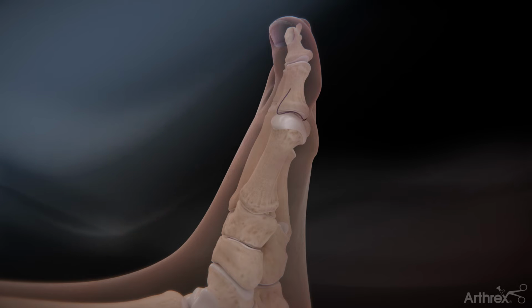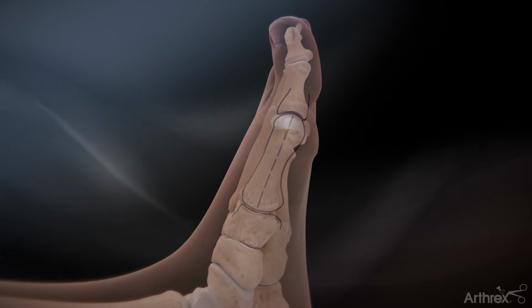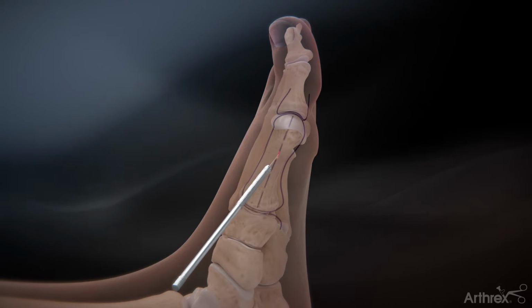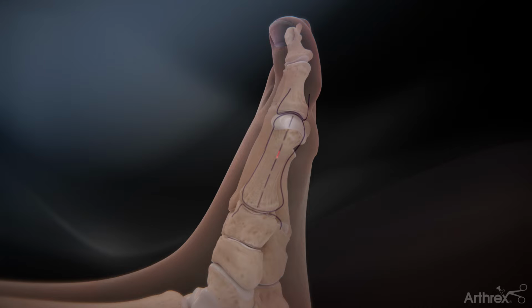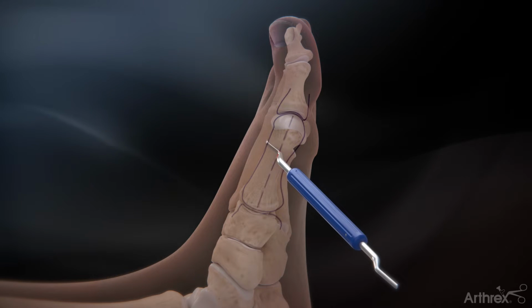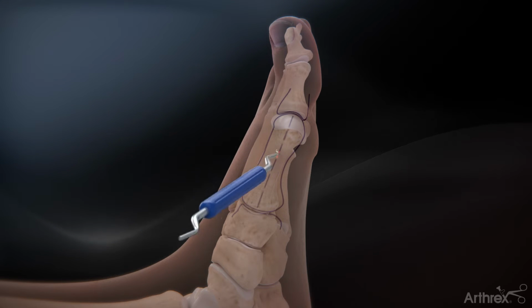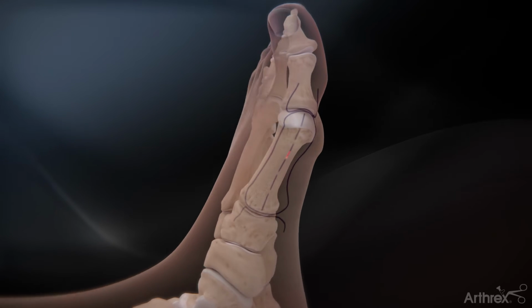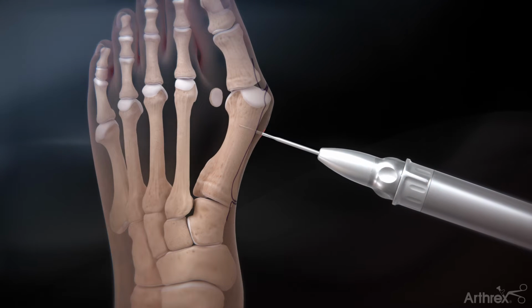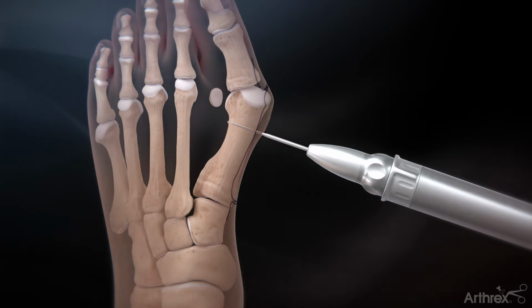To begin the procedure, mark the bony anatomy and midline of the metatarsal. Make a stab incision on the midline of the metatarsal, just proximal to the sesamoid complex. Use the periosteal elevator to free the soft tissues at the osteotomy site. Insert the 2.0 by 19.5 mm burr through the incision at the midline of the metatarsal through both cortices.